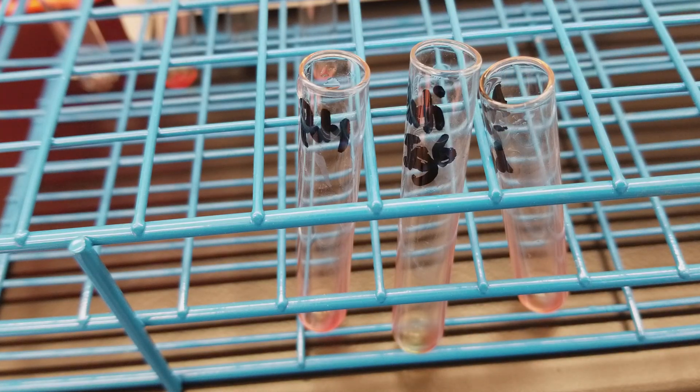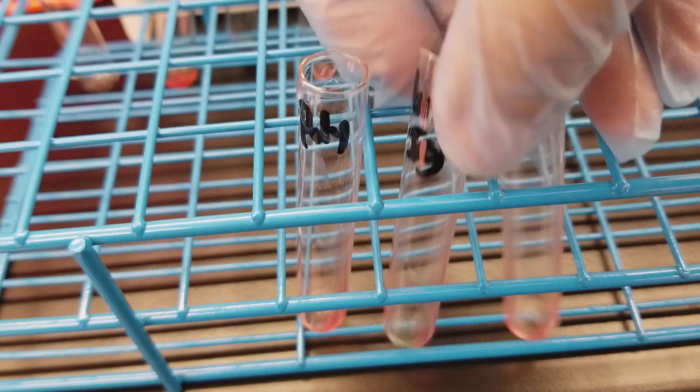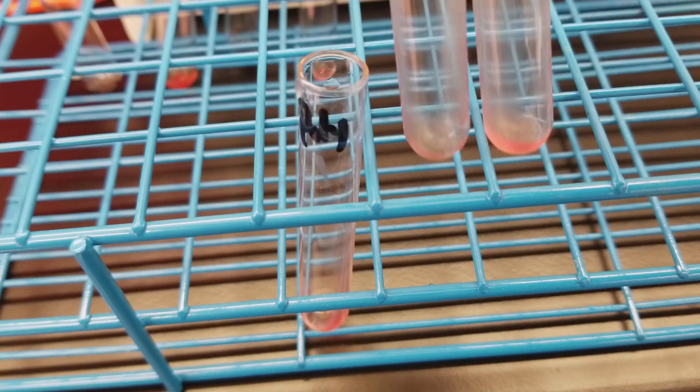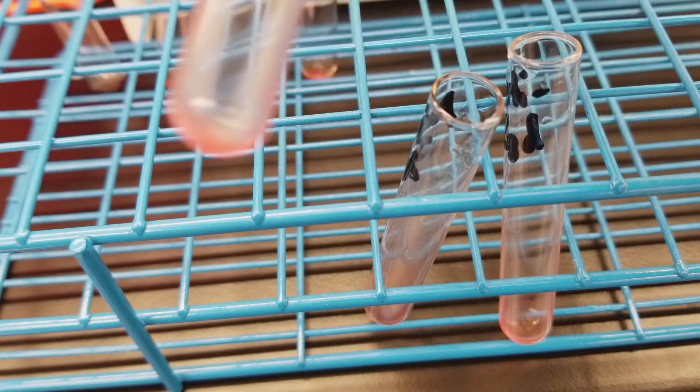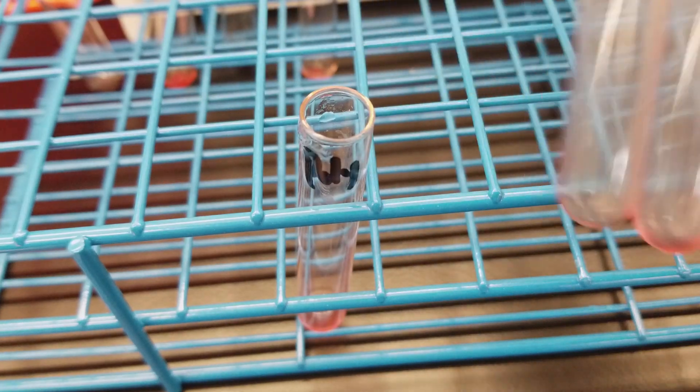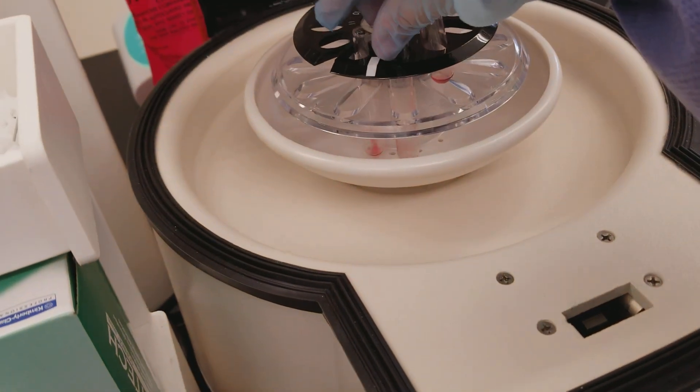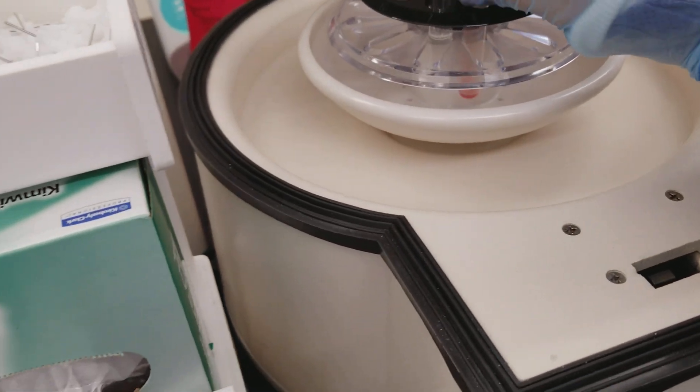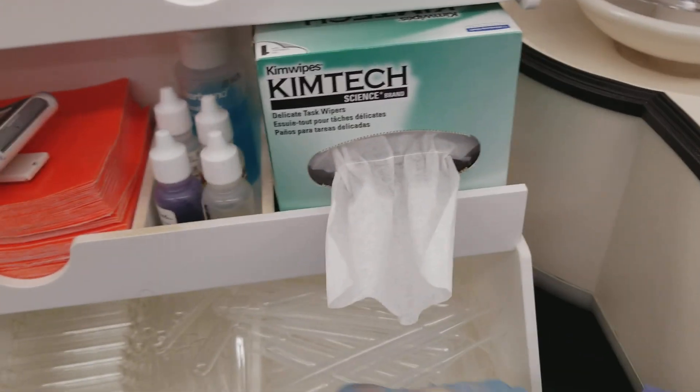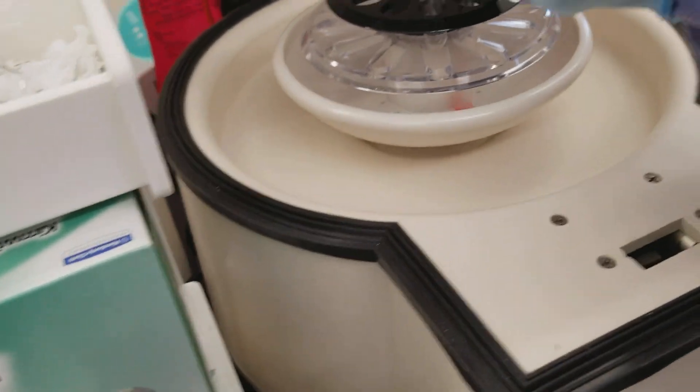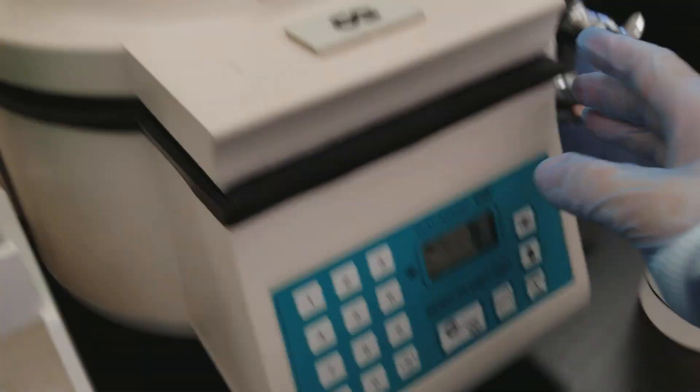Now that we've done that, we've done polyspecific of both, which has many epitopes. And then we have monospecific of the other two, which is going to just detect the one. And so we're going to gently swirl them and then put them into the centrifuge. Put a blank one in.